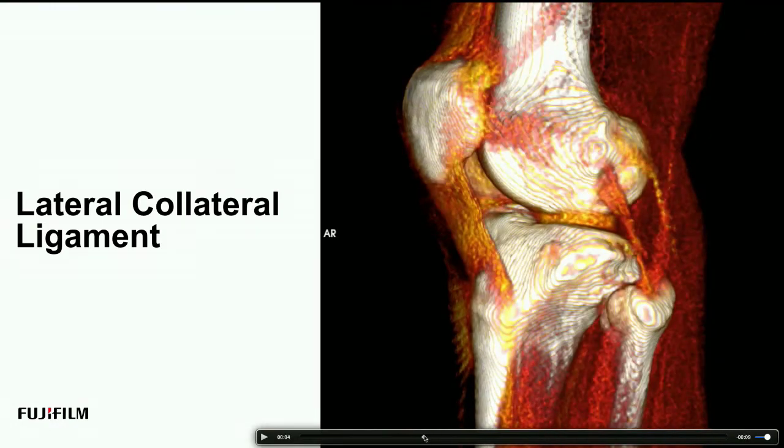And you may be a little bit lost in which direction to orient the probe. So most people just start in a mid-coronal plane, and they end up looking for what appears to be a bright fibrous structure jumping over the joint, and they would call that the LCL, and just keep going. But we have to rely on our bony landmarks.